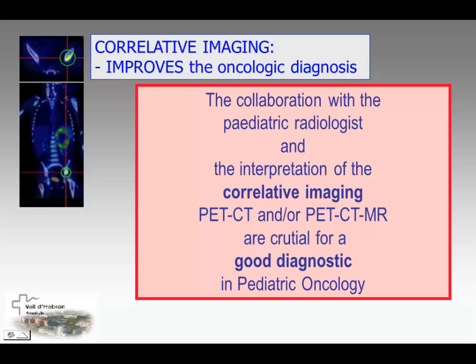And for false positives, if you perform a whole body bone scan, you can detect the blood pool increased in some of the articulations, and after that you can see whether or not there is a diffuse increase of the bone uptake in this articulation. And you can also detect, after the treatment, areas of osteonecrosis. I don't know if I answered your question.